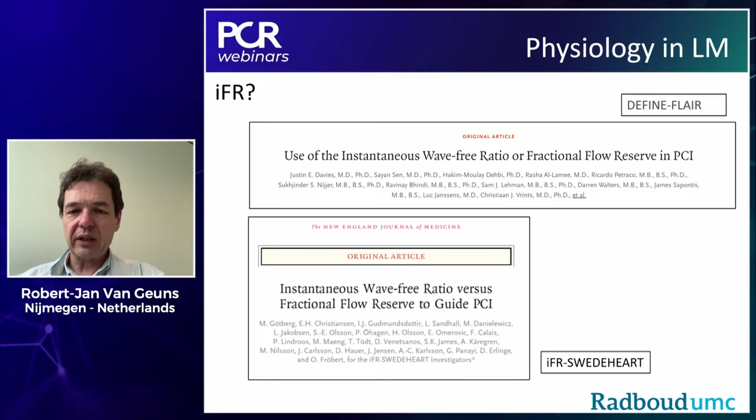What do we know about iFR? Now, we have the larger studies, which are SWEDEHEART and DEFINE-FLAIR. These excluded left mains in their analysis, but last year, 2021, there has been a dedicated study for left main, showing that iFR is a similar size as the FFR studies, around 200 patients, showing that deferral based on iFR is as safe as based on the FFR.